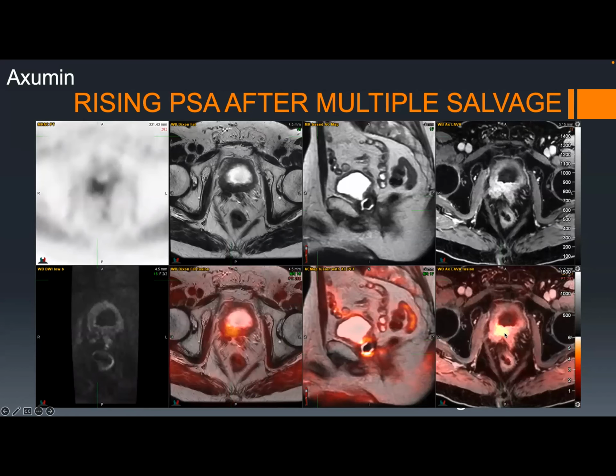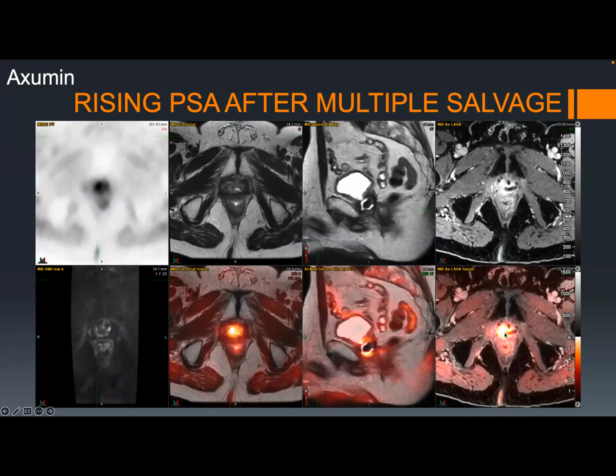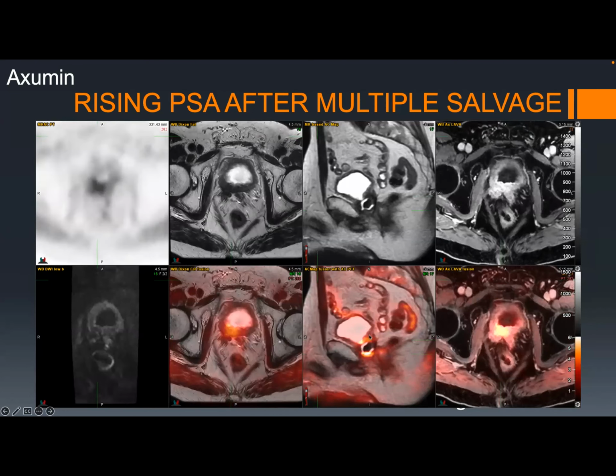Similarly, this is the same patient, this is now the superior aspect, this is the inferior aspect, and you can see that really the sagittal helps a lot, where you can fuse it to the sagittal MR and definitely give diagnostic confidence that, hey, this is peripheral recurrence all around here. You guys, this is where you need to target.